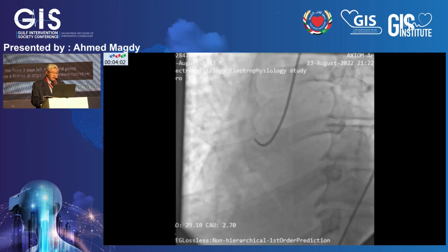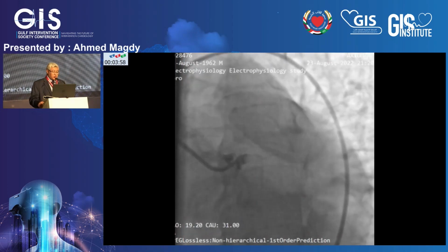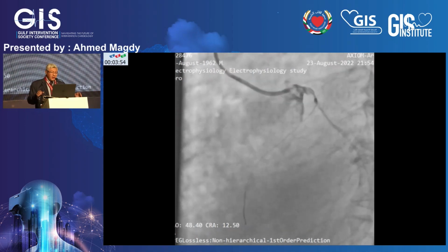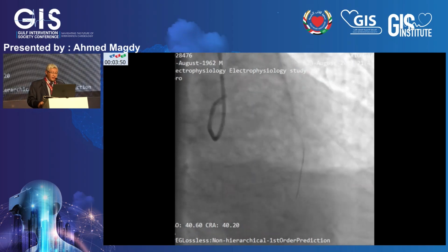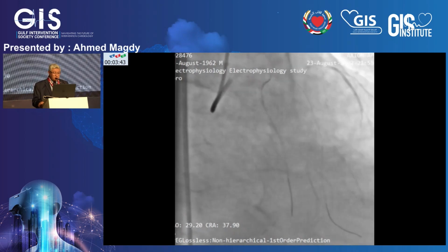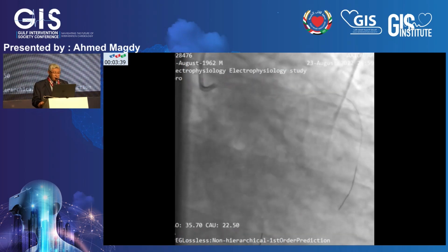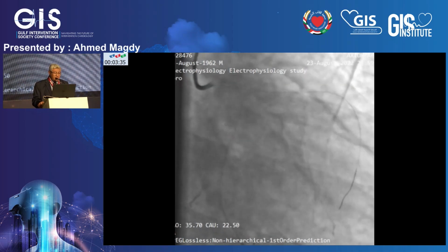So this is another patient. He had a total left main occlusion. Again, we can say this is a surgical case, but in these cases, of course, with such poor contractility and low blood pressure, he may need ECMO or Impella, but this was also after midnight. So we try to pass wires in both arteries and open whatever you can.